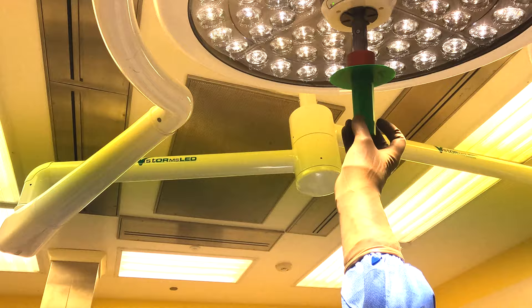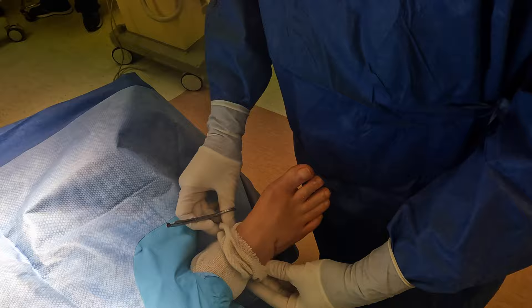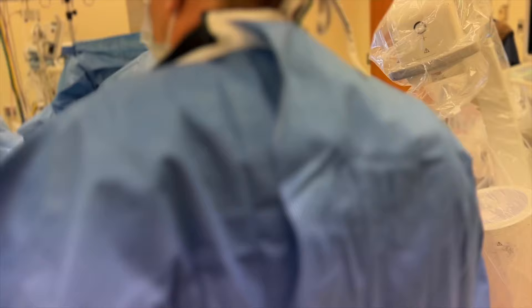This is how we do it. These are the lights so we can see during surgery. Now we're putting on our drapes - this makes a sterile field. We're getting the blood out of the foot, we put a tourniquet on to stop the bleeding. We have a whole team of people. We're using intraoperative x-rays to find the needle. We make our incision, pull it out - and here it is.